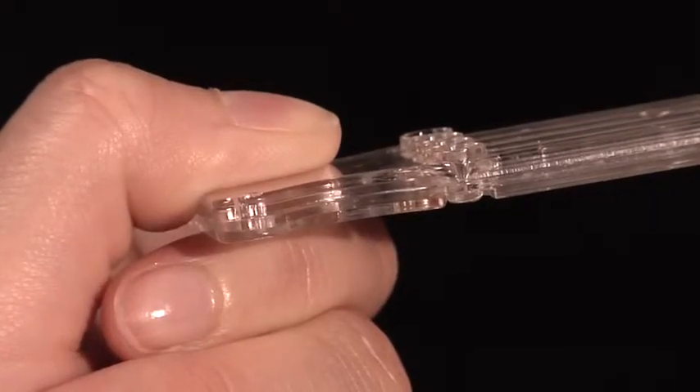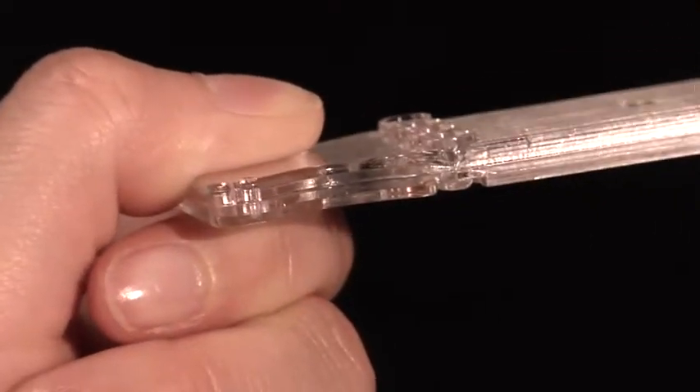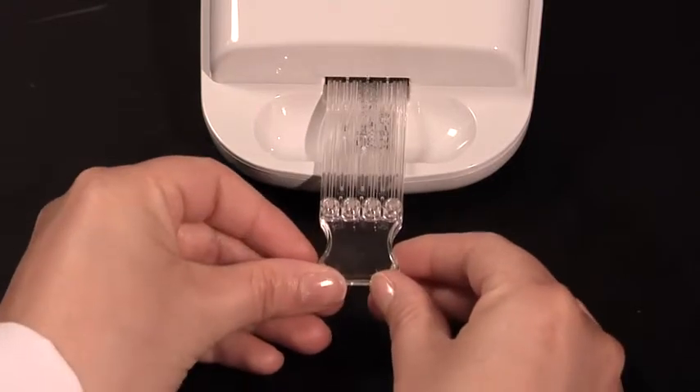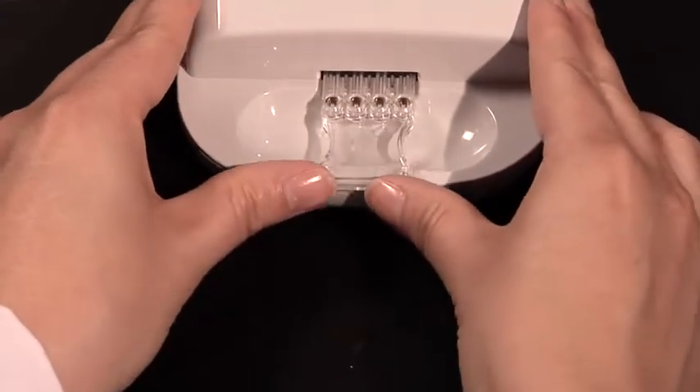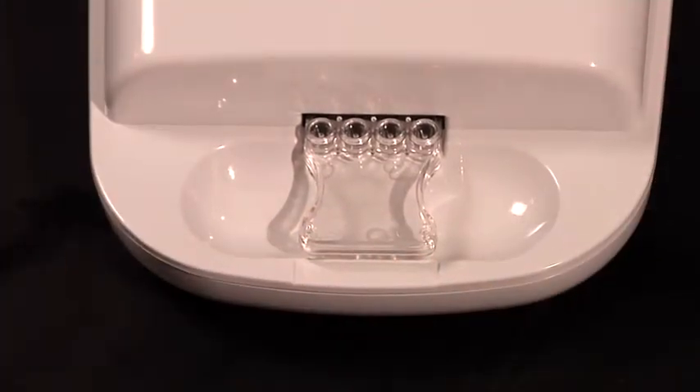Once the cartridge is fully removed, do your best to touch only the handle end of the cartridge as you begin to place it in the reader. At this time, with the wells facing up, insert the cartridge gently, then pressing firmly all the way into the slot at the front of the reader.